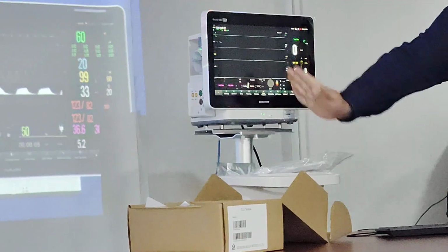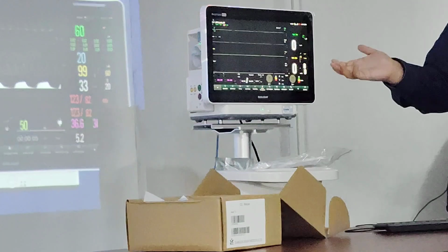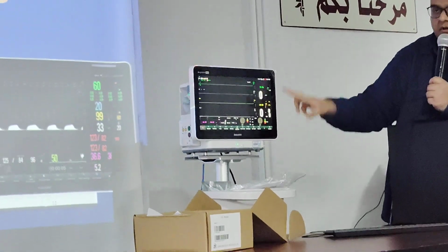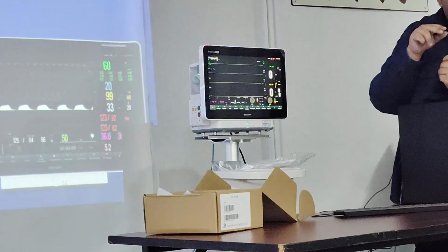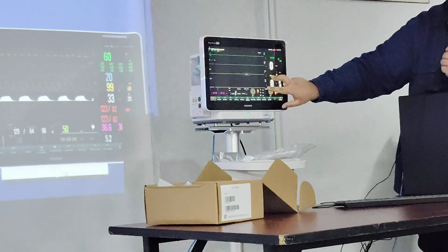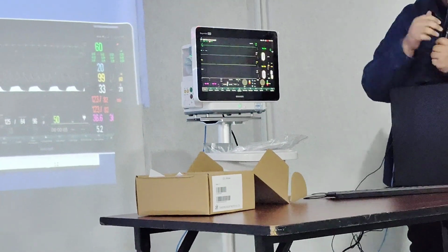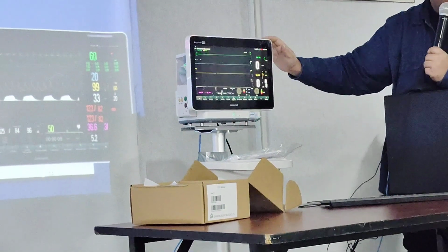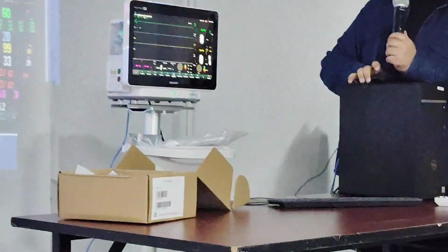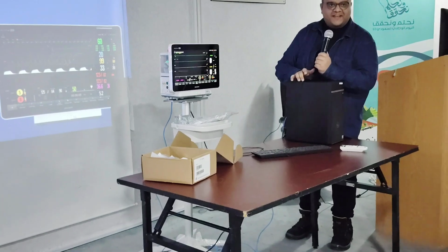So this is on the right side of the screen, okay? This is a capacitive touch screen, just like on your phone. So you're able to do multi-finger gestures on here. So for example, you see I have decreased the volume to 2. You guys are a bit far. If you want to come closer, please. So we don't know this one. Okay, now you know. Now we know. Now you know.